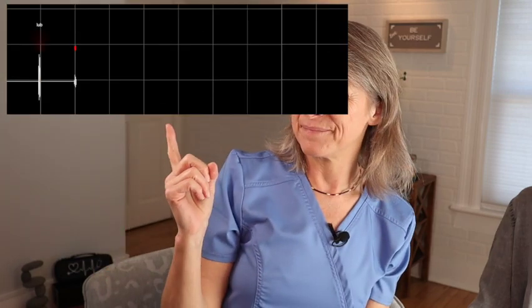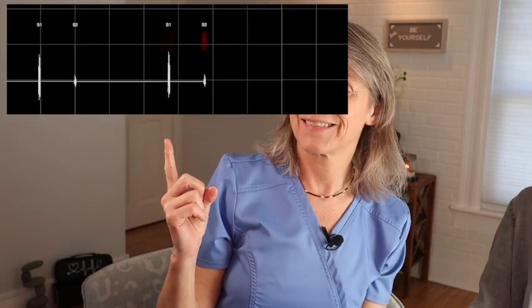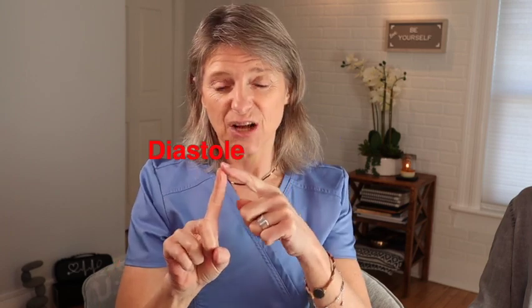And that corresponds to what I know in the medical field as lub-dub. Lub-dub, lub-dub, lub-dub. And of course, what we really want to be using is S1 and S2. When we think about S1 and S2, 1 is systolic, 2 is diastolic. So we really want to make sure we map that out and understand that because that's going to correspond to lub-dub, boom-boom, whatever you want to use, S1, S2.